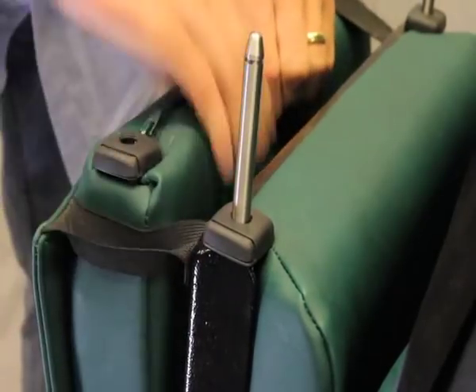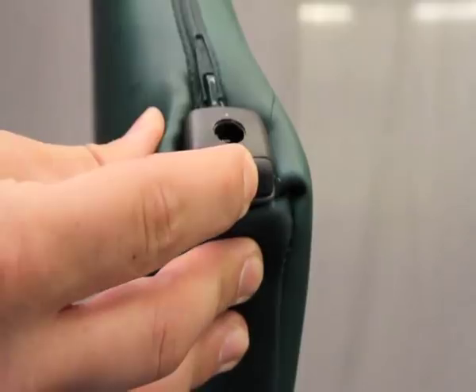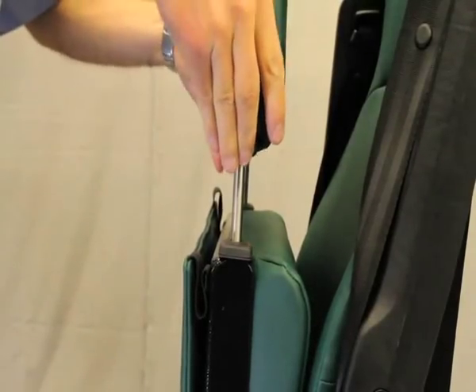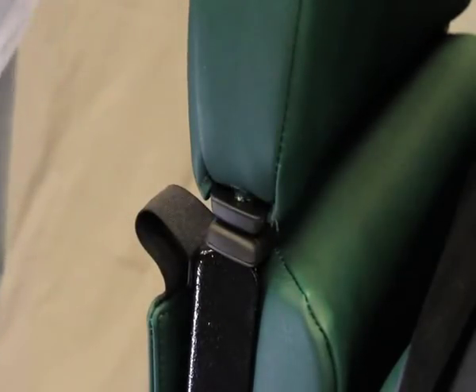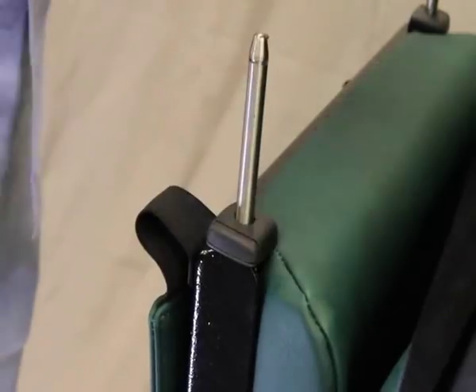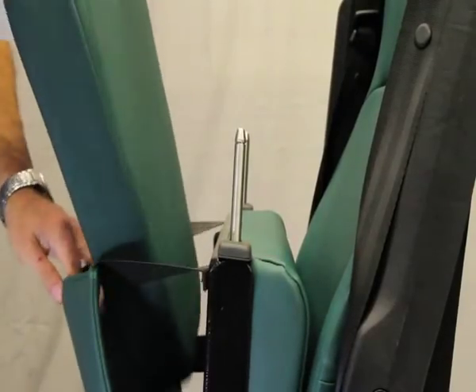Remove the extension cushion from the elasticated pouch. Squeeze and hold the catches, align the holes with the stalks and push the cushion into position. To release the cushion, ensure you press and hold the catches and lift off. Store the cushion back into the pouch.